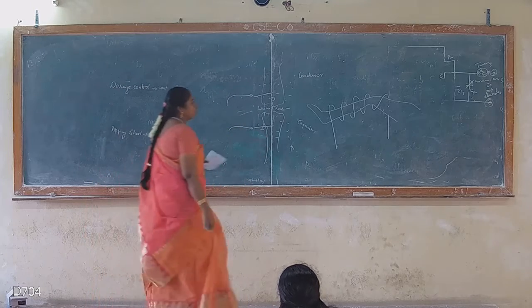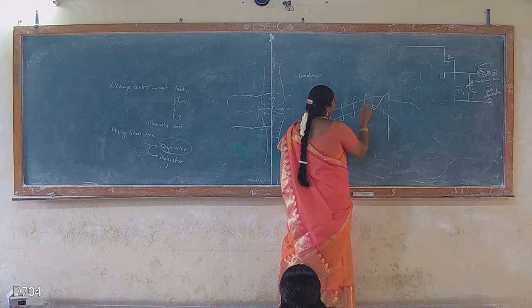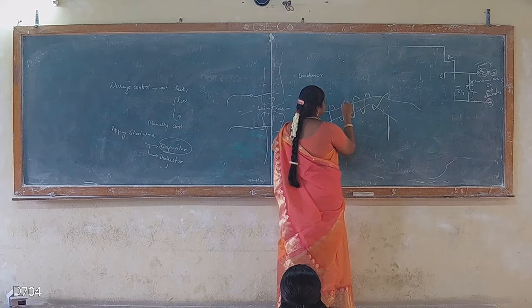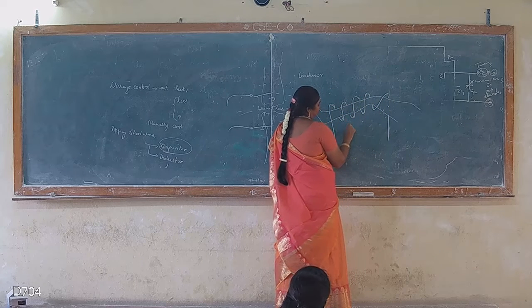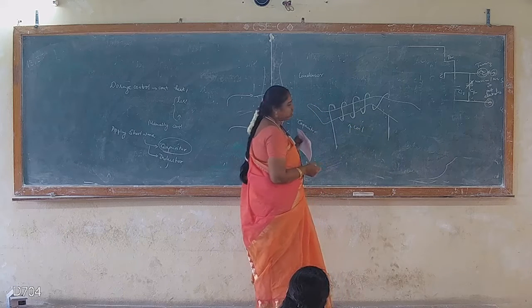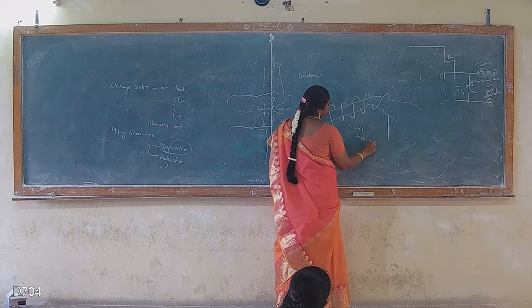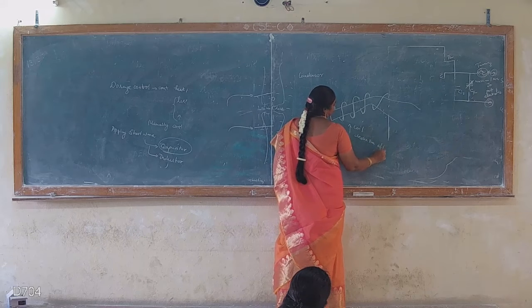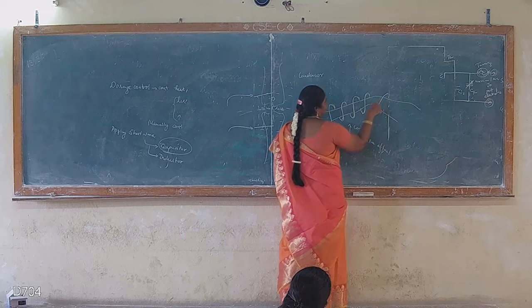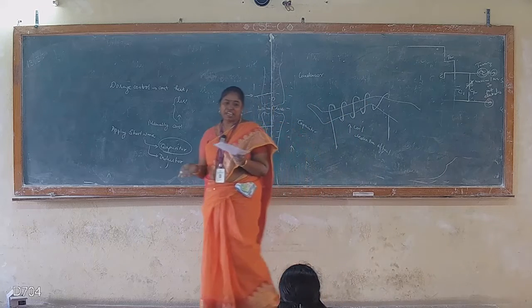Because the cable is wrapped around the area to be treated, it provides the effect of a coil. This effect is called the inductive effect. So with the high frequency current, through the inductive effect, there is the establishment of a magnetic field.